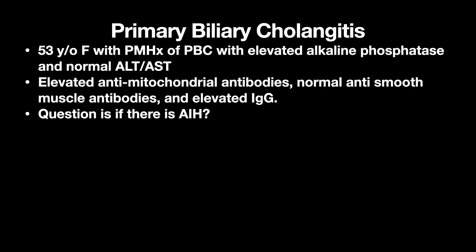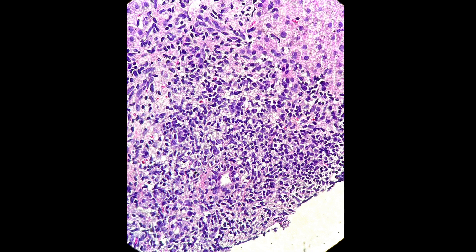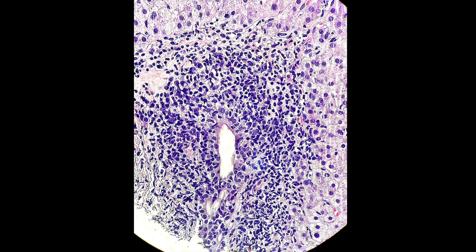This is a case of a 53-year-old female with a prior history of PBC, elevated ALK-phos, normal ALT and AST, elevated anti-mitochondrial antibodies, normal anti-smooth muscle antibodies, and elevated IgG. Given the elevated IgG, there's a question of whether there's an element of AIH. We can see inflammation in the zone 1 portal tracks. Looking closer, there are histiocytes, making this a predominantly lymphohistiocytic inflammation. You can have plasma cells and some eosinophils. But the bile ducts are being attacked by histiocytes and lymphocytes — here it's hard to distinguish what is bile duct epithelium and what is inflammatory cells.